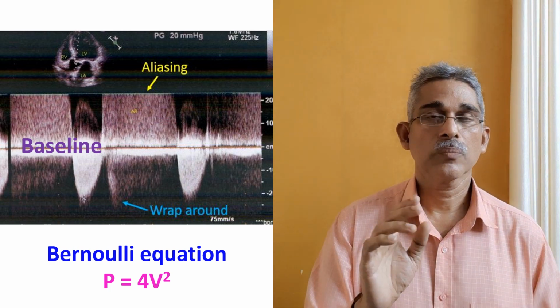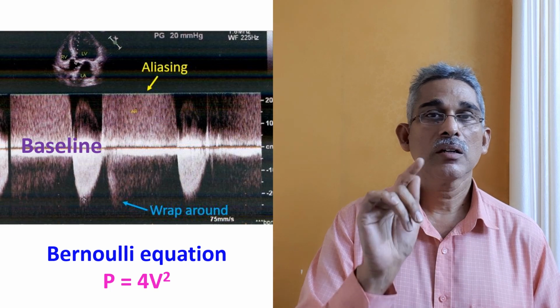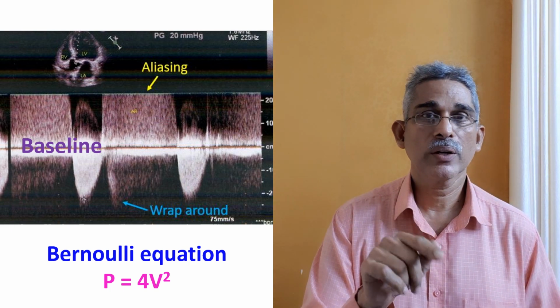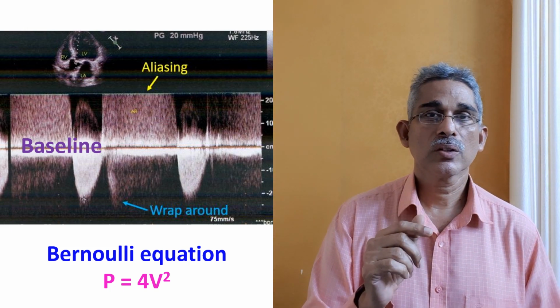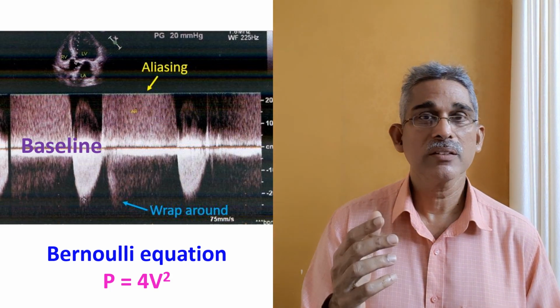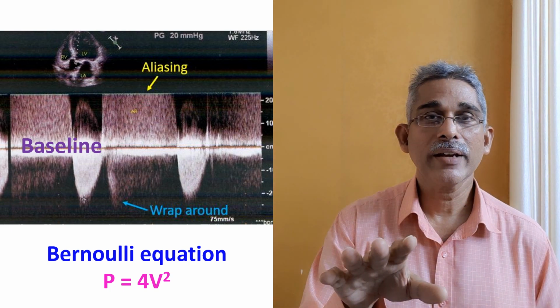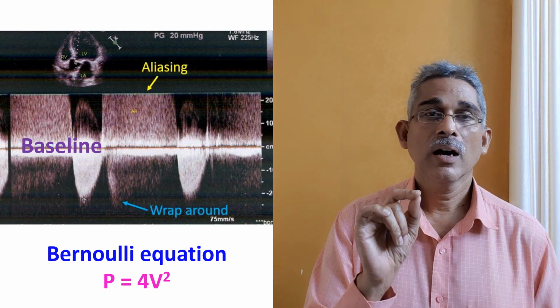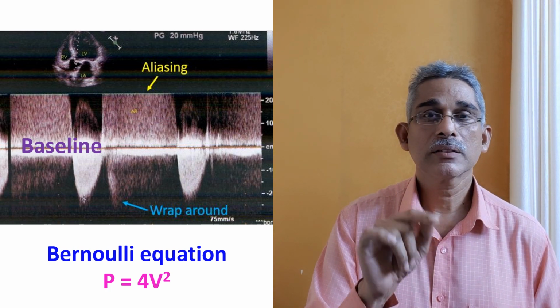In pulsed Doppler, you use it only for finding out the exact location where the abnormal flow is there, and also for normal flows. But with the onset of color Doppler, you actually don't need these things. You have to put the color Doppler, find out where the jet is located, and then you will use either continuous wave or HPRF. You will not use simple pulsed Doppler.